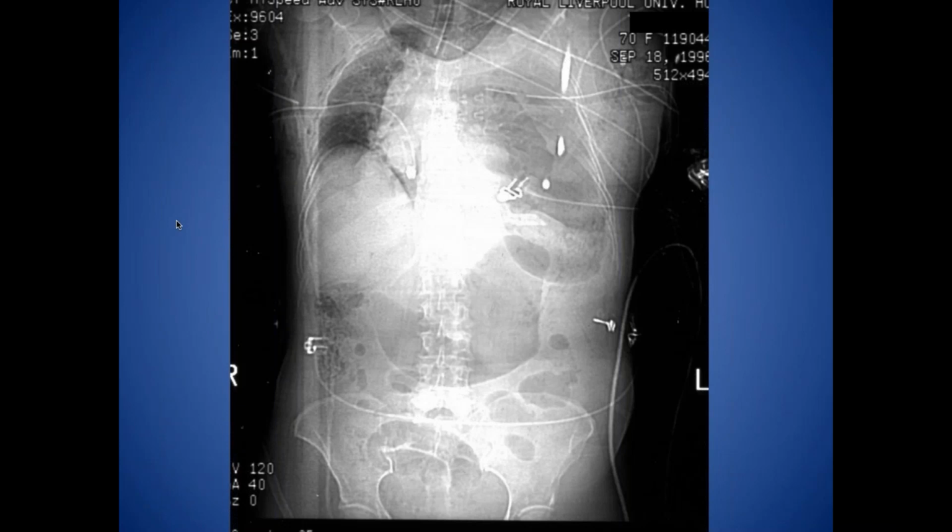The green needle gave us a bit of time to put another chest drain in. And it just goes to show that even though the patient has got 2 chest drains in situ, the radiologist doesn't always know whether those drains are working. Maybe they are blocked, maybe somebody's clamped them. So always bear that in mind.